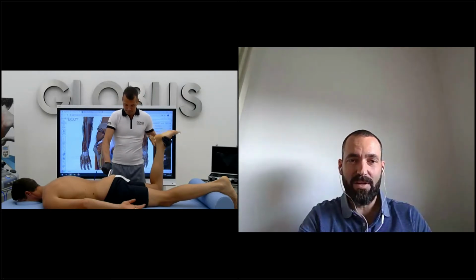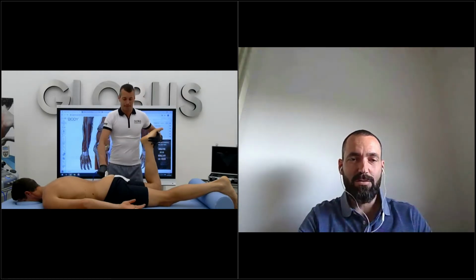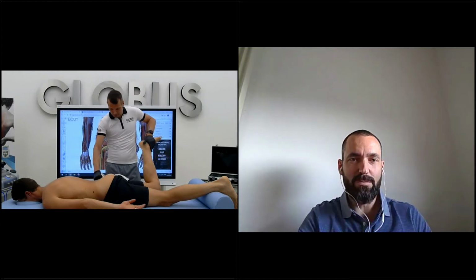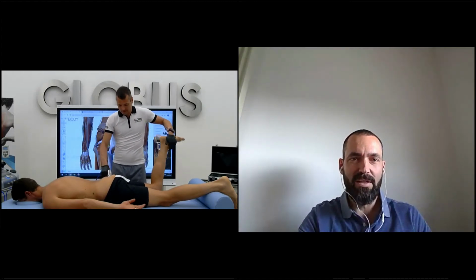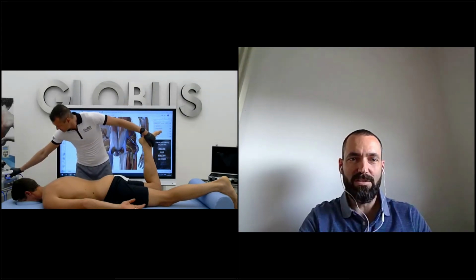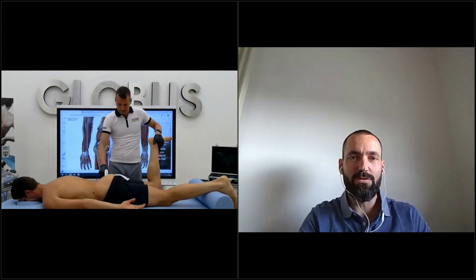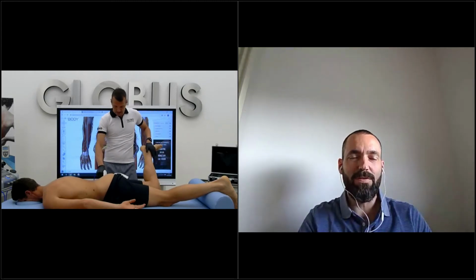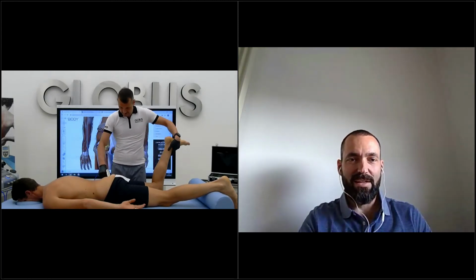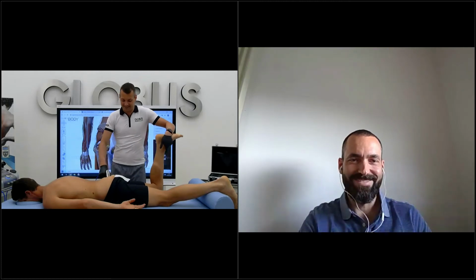In this special case he has a good gluteus maximus, so you have to go through the gluteus maximus to reach the piriformis. You cannot go superficial, so you have to go really deep. After this kind of treatment, you have hand pain for sure. Exactly.